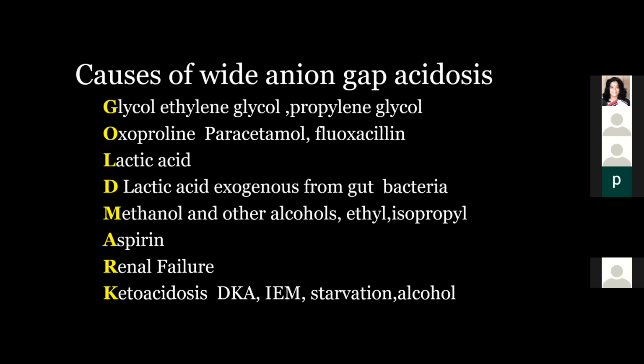And in ketoacidosis, you need to add alcohol. So there is a strong suspicion that this could be an alcoholic ketoacidosis, which this child is having. He could have been vomiting before, that's why I found the metabolic alkalosis. And now, because of all this osmolar accumulation, he's got altered sensorium, etc.